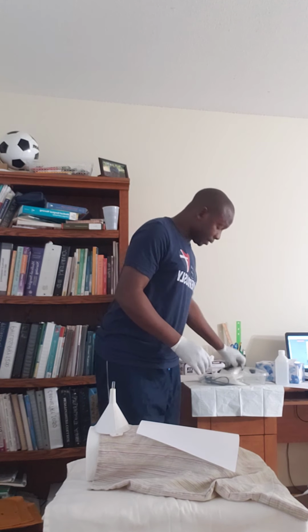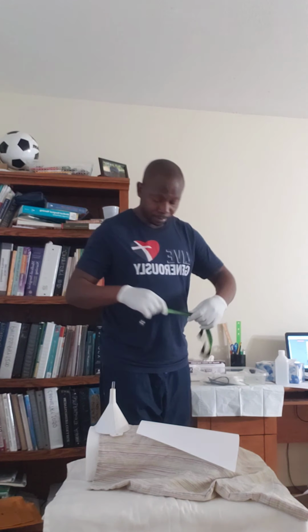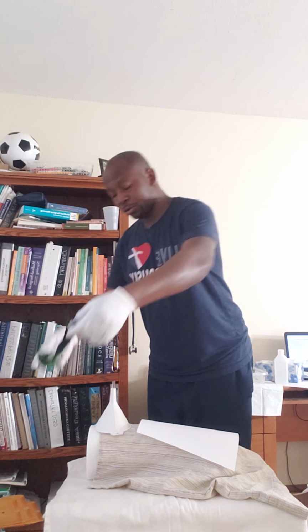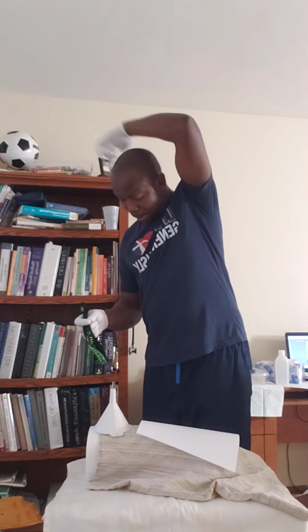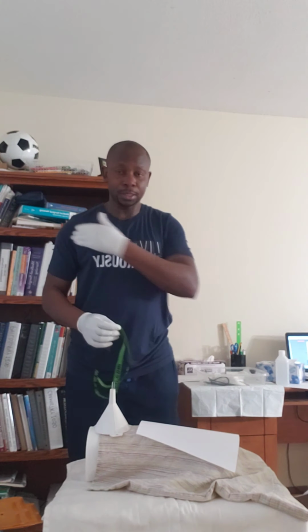Then I'm going to bring this one. The string will hold, will go on the patient's back, and then will hold my patient. And then I will remove the other one, and then I will clean everything that is there, making sure the area of my patient is dry, but moist, not dried too hard.